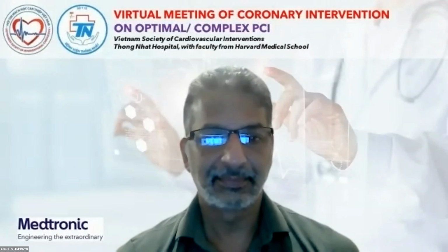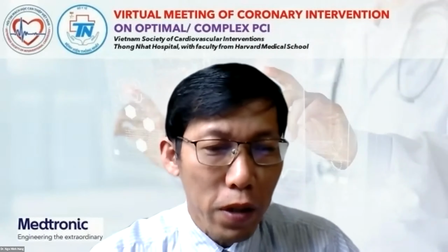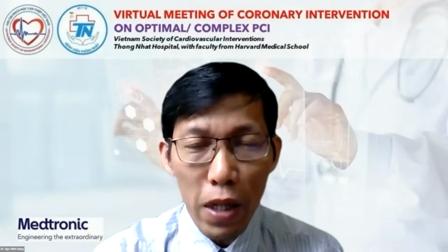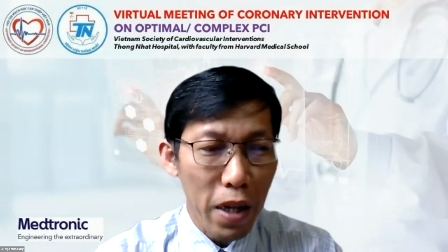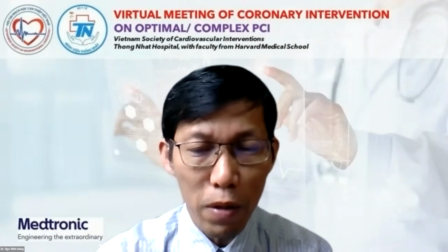Yes. So usually nowadays we use a lot of DES, and of course we're facing bifurcation lesions. So I think that the bifurcation lesion is at high risk of ISR. So with the true bifurcation ISR, how do you deal with that without the DCB?